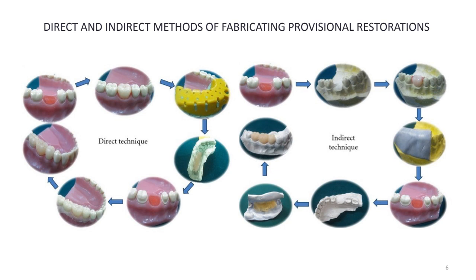The dentist can use what's called the generic tooth shell, fills that tooth shell with acrylic, puts it over the temporary abutment, removes it from the patient's mouth to reshape it, trims the excess acrylic, polishes, and then inserts it in the patient's mouth with temporary cement.